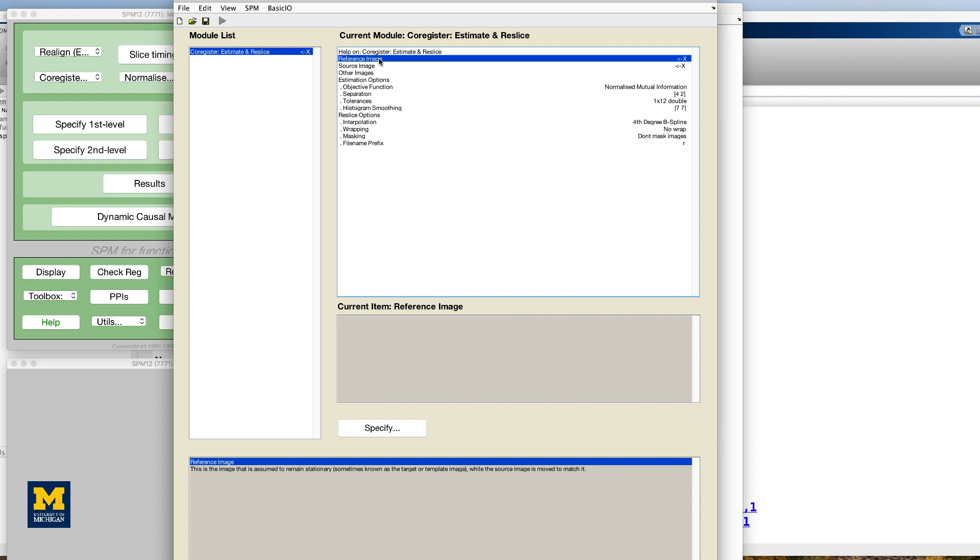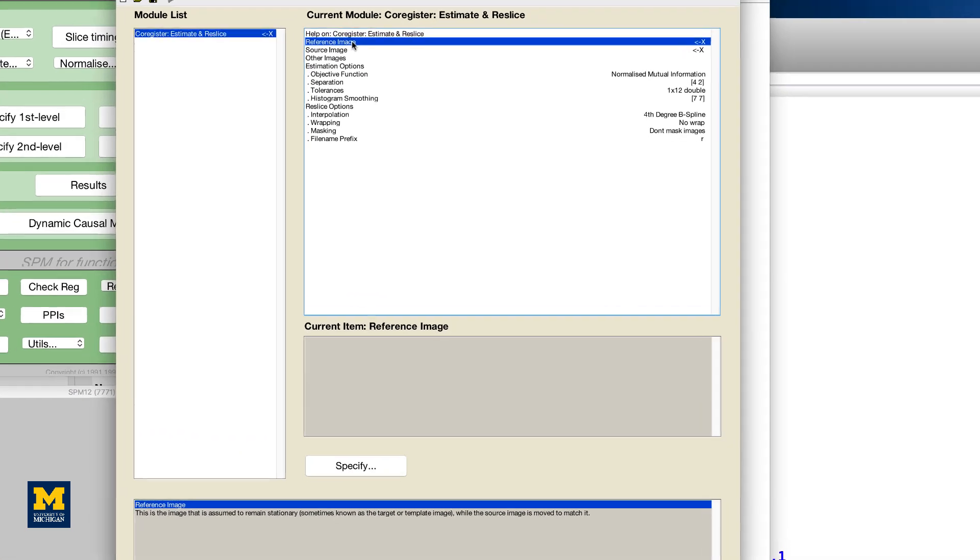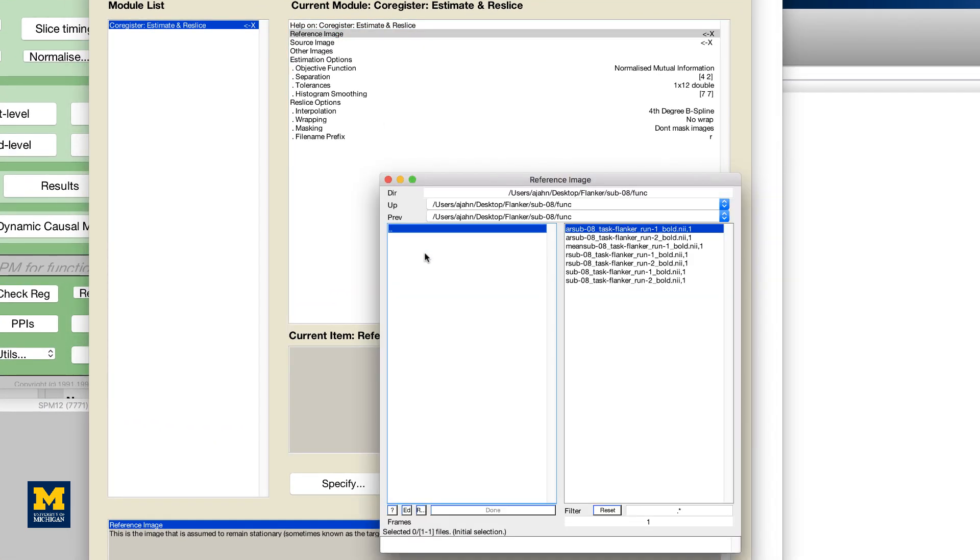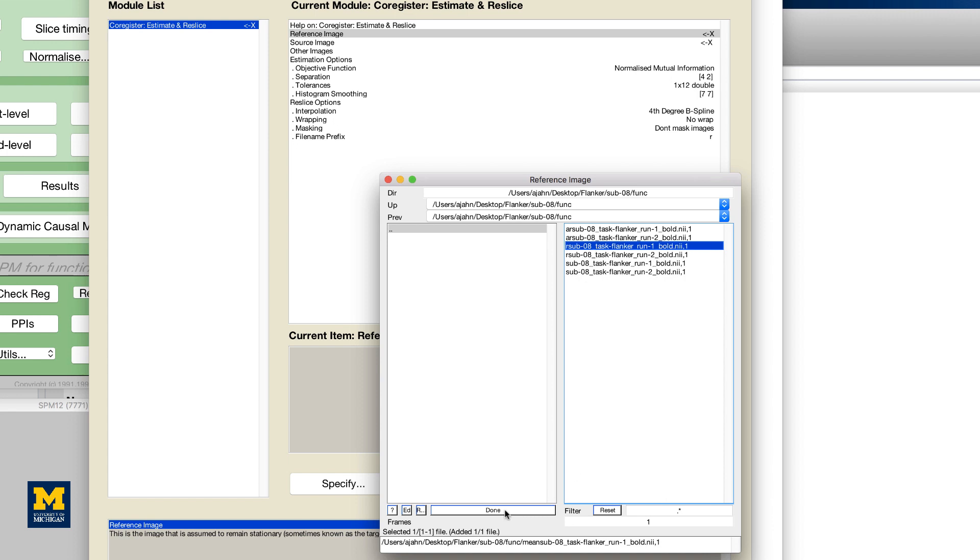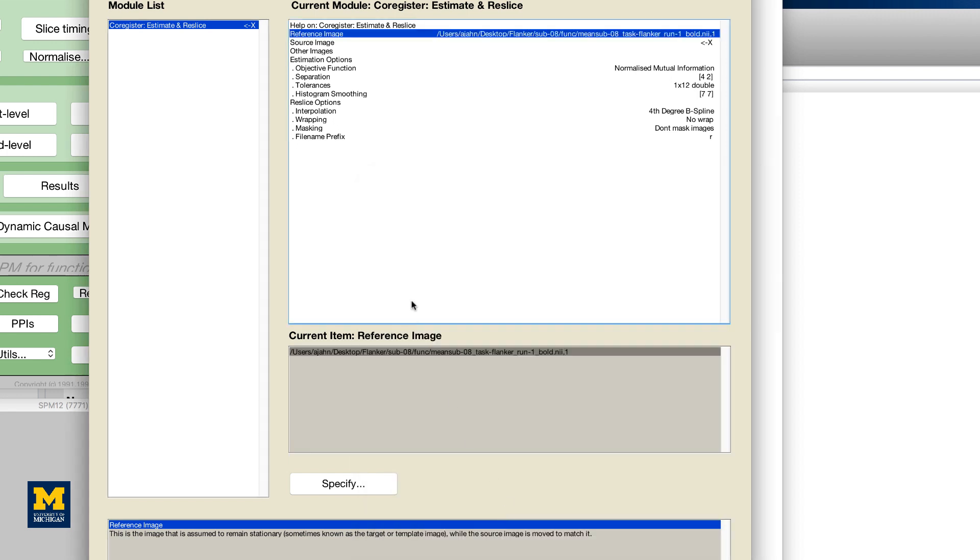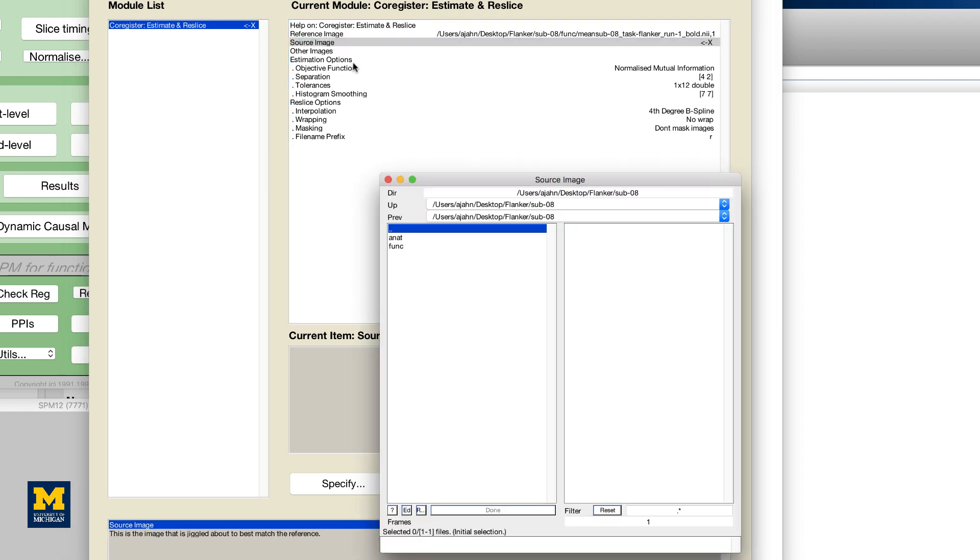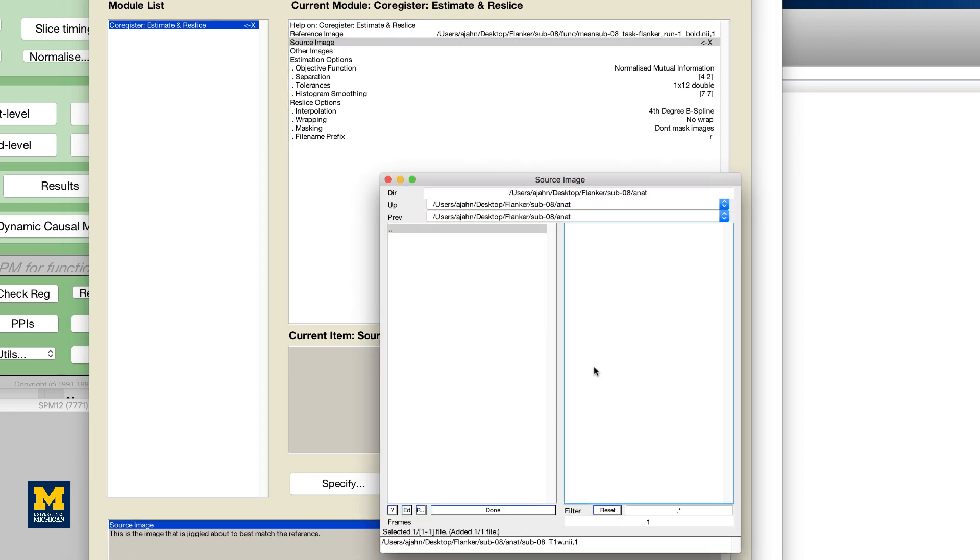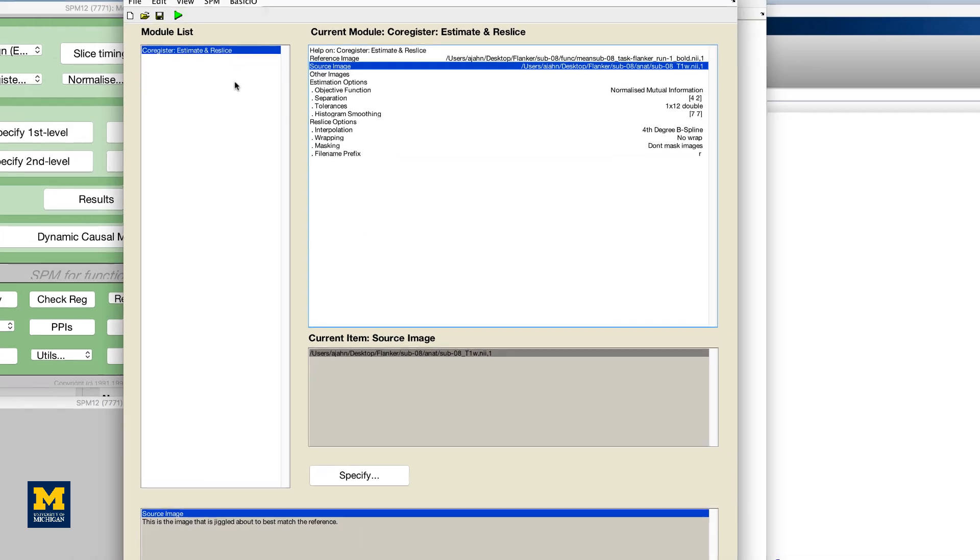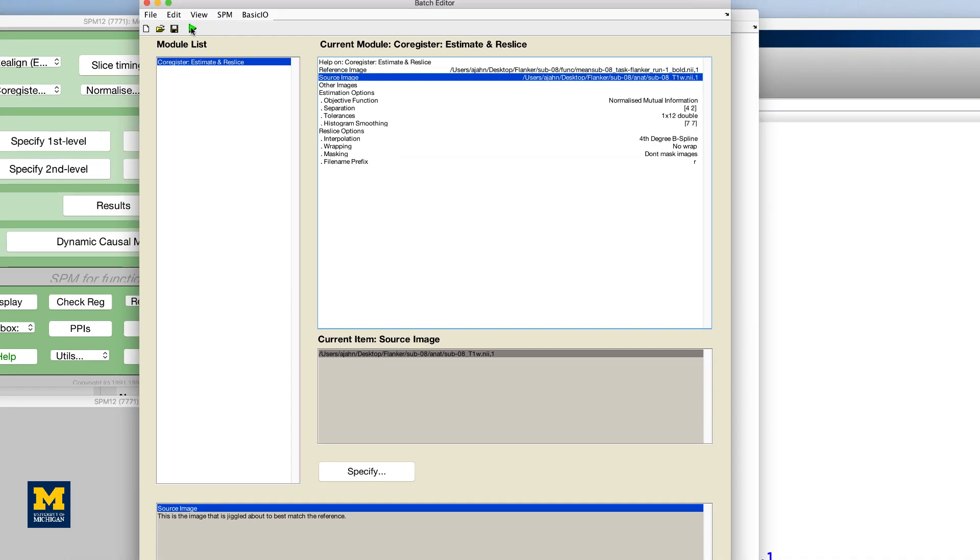For most experiments, you'll want to use a representative of the functional data as the reference image and the anatomical data as the source image, since we generally want to make as few changes as possible to the functional data. Double-click on the reference image and select the mean sub 08 taskflanker run 1 bold image in the func directory. For the source image, navigate to the anat directory and select the file sub 08 t1w.nii.